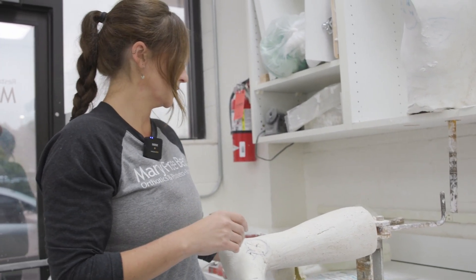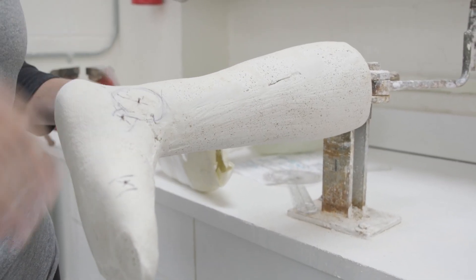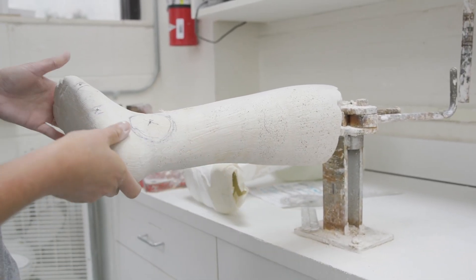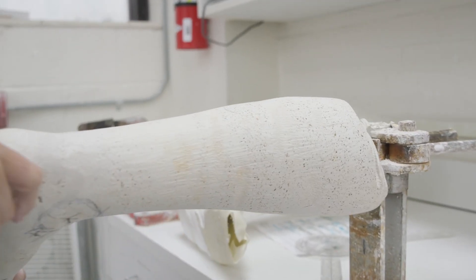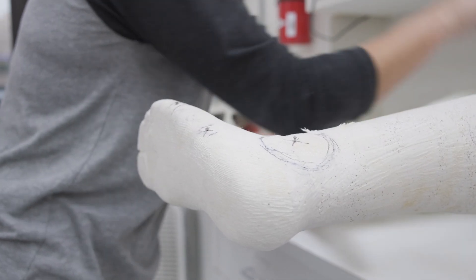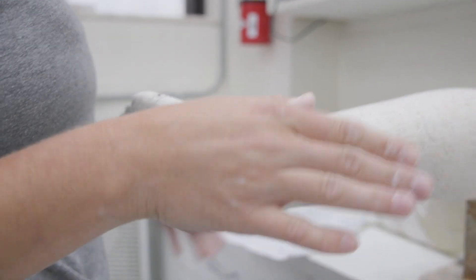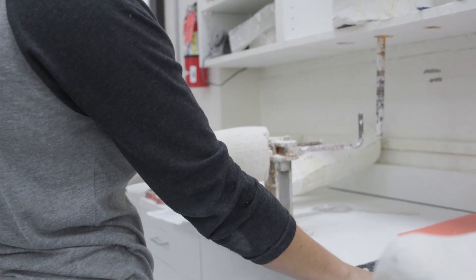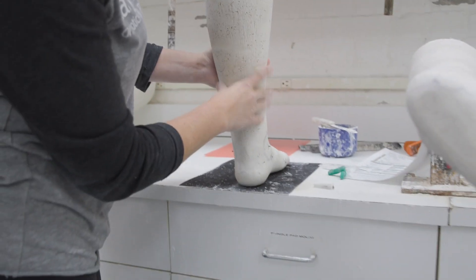Once that's completely dry, this is what it will look like and you can take the cast off. We usually will lightly shave down the calf area to get any of the smaller bumps out. We also have to look at the work order to see if they want a heel at all or a flat surface — so this one would be flat surface. We usually sand it on this screen right here to make sure the whole foot plate would be flat so the patient is able to stand.